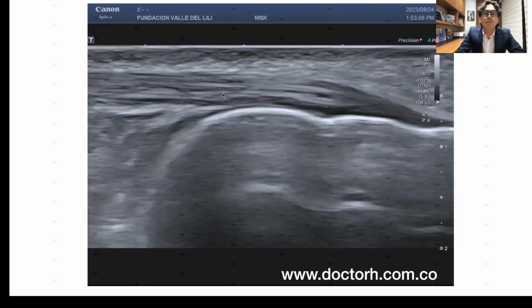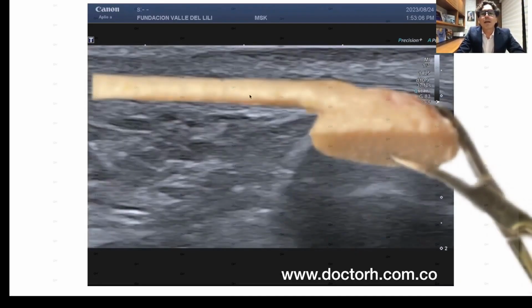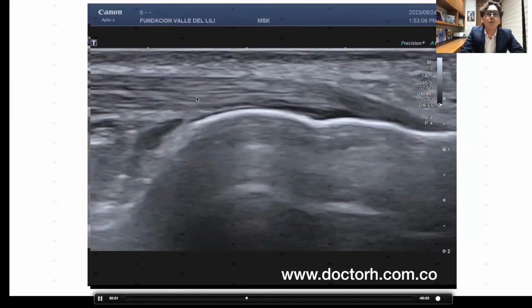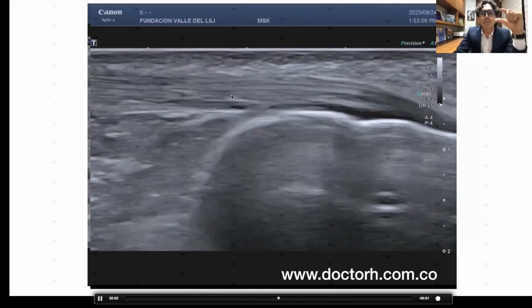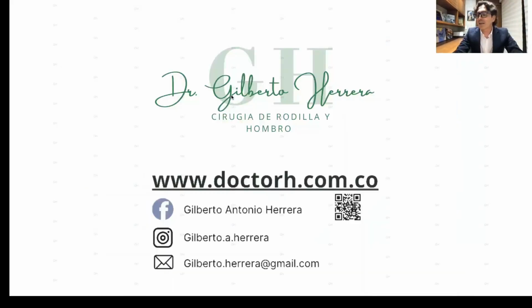If you remember the histological drawing we showed at the beginning, this is very similar. This is a calcaneus, and the image of the tendon would be this, some very well organized fibrillar images. This is a criterion for a healthy tendon. We will also see it when it is pathological. We will analyze the same sequence. So tendon anatomical structure is fundamental.